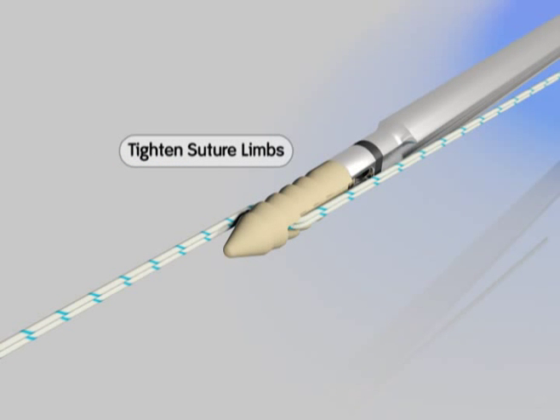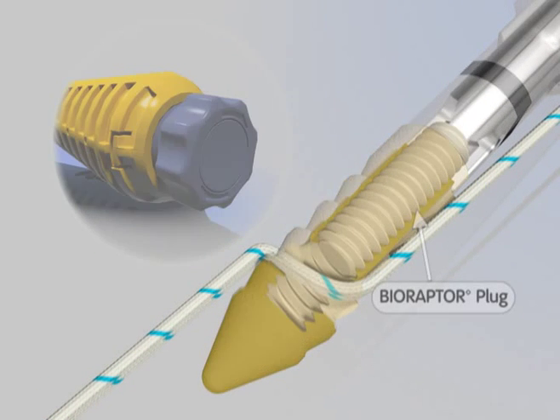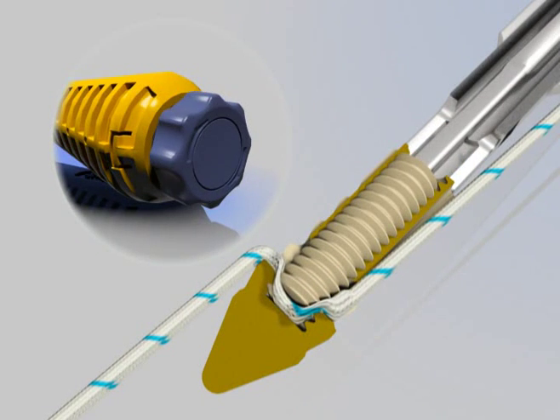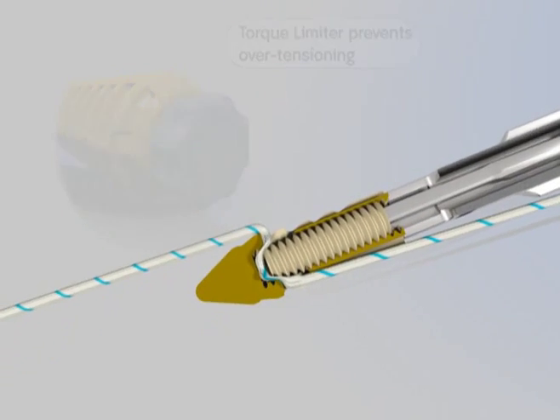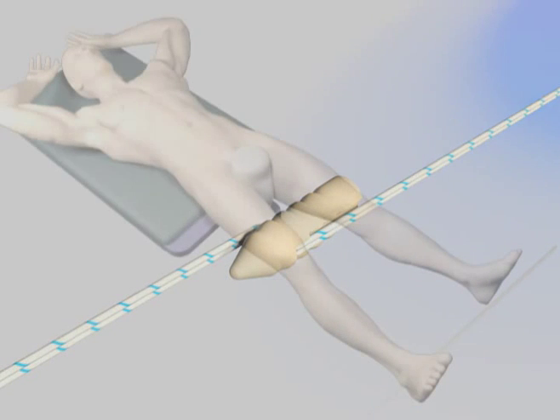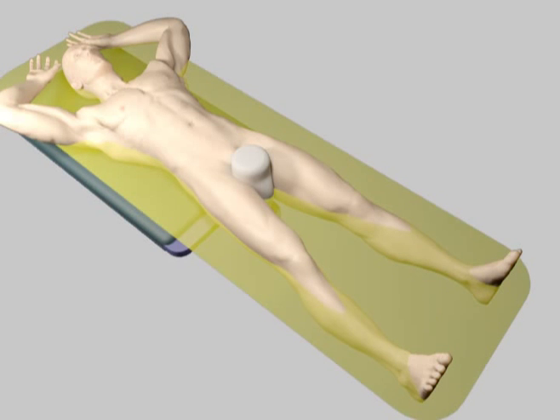The suture limbs are tightened and locked on the handle, and the torque limiter knob is turned 8 times to lock the suture into place. The torque limiter measures the travel distance of the inner plug, ensuring it is properly advanced inside the anchor and locking the suture. Now we will review the technique in detail in a patient.